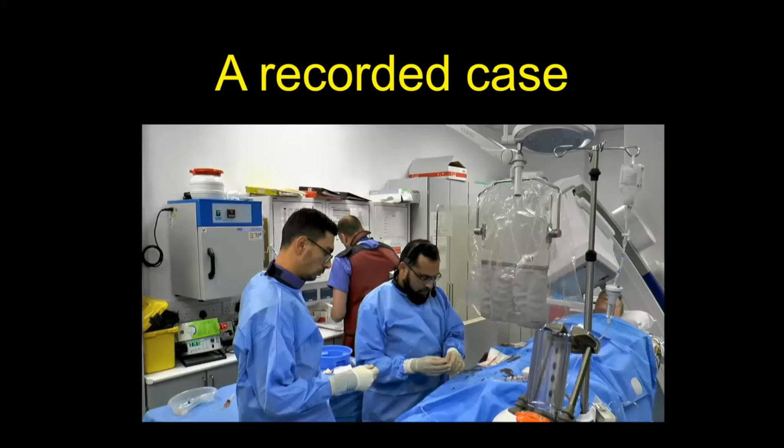So whether it's a STEMI and you have stented, or you have just done some export catheter thrombus aspiration, or you think it was just a small plaque eroded and you didn't need to do anything, if there is good flow and you have given the appropriate antiplatelet, anticoagulant therapy, patients will be fine. Farhan has an argument against it.